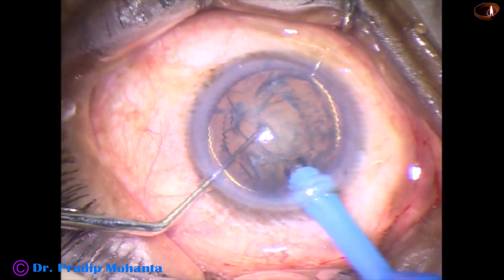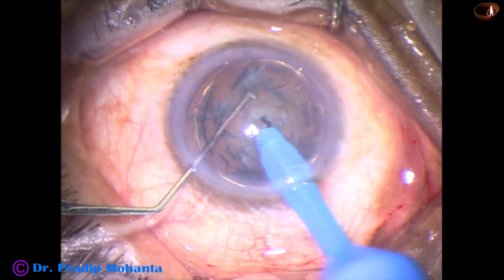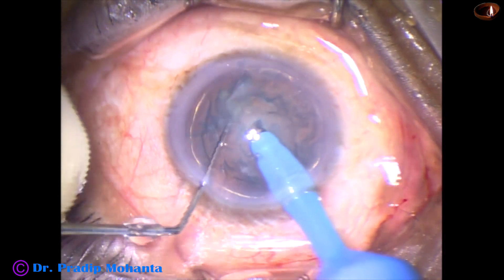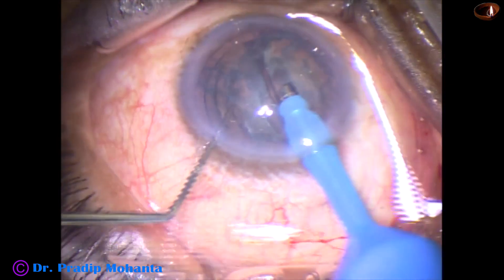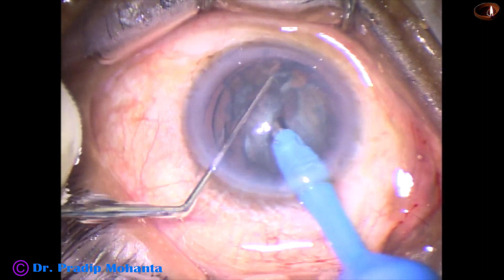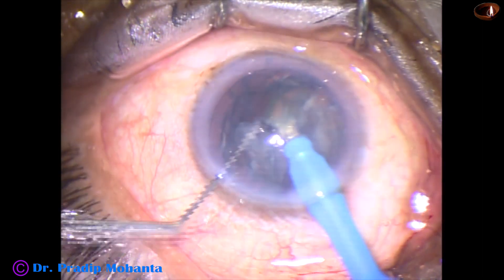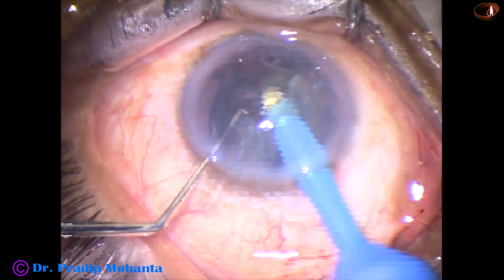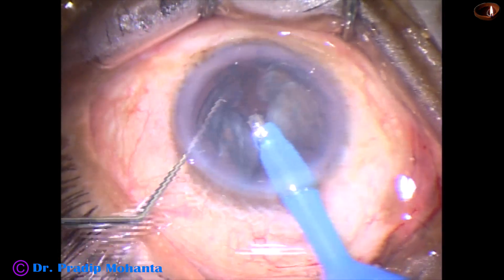Some superficial cortical lens matter is removed, then the handpiece is turned and the bevel is made towards the cornea. And now, direct chop. It is very easy to chop these cataracts of grade 3 nuclear sclerosis — you just have to bury the tip into the substance of the nucleus, hold it very nicely, and use the chopper to chop it into fragments. No need of making any trench in such cases.